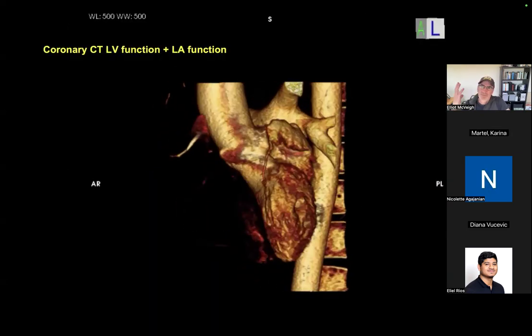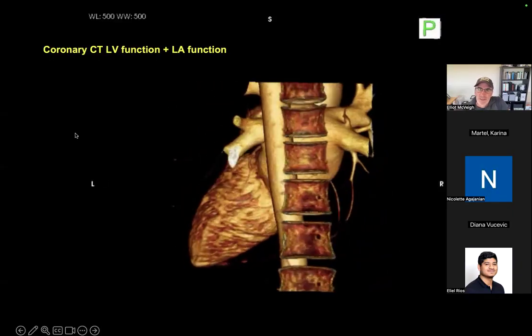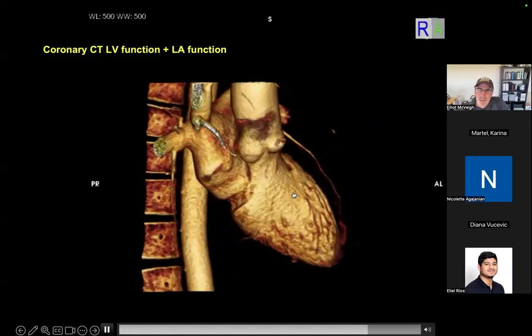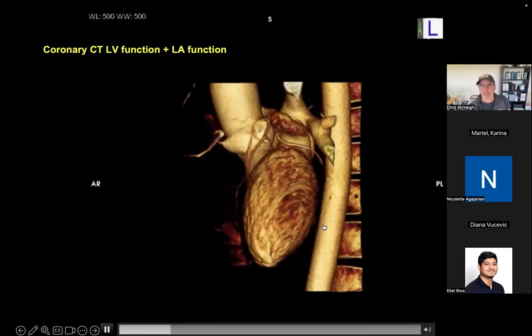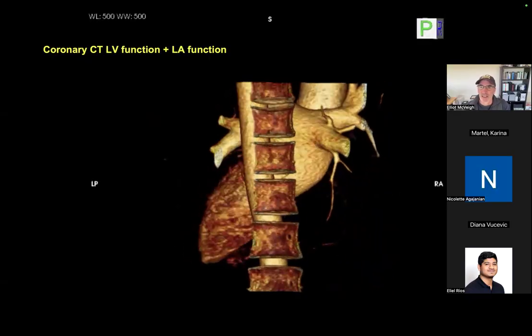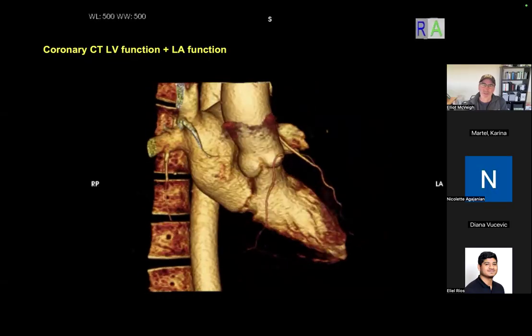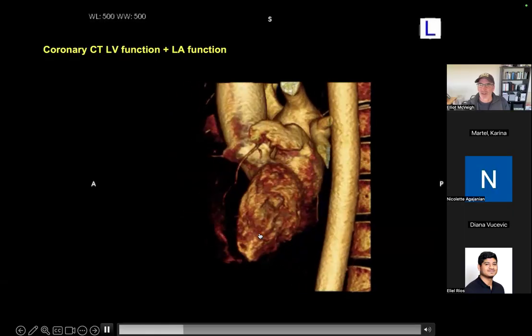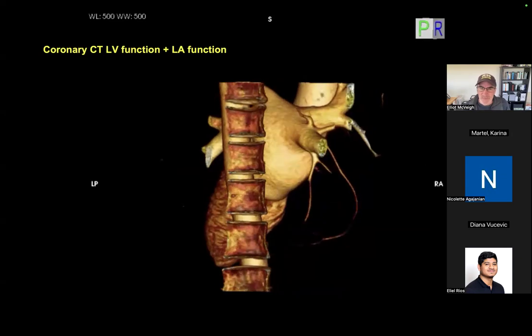It becomes instantaneously obvious. The 3D view is excellent for looking at cardiac function. We have filled the heart with contrast for this beat. This is probably at the peak of that contrast, and so we get essentially a cast of the left ventricle and the left atrium, the aorta, and where that contrast exists inside there, we basically don't see through it.